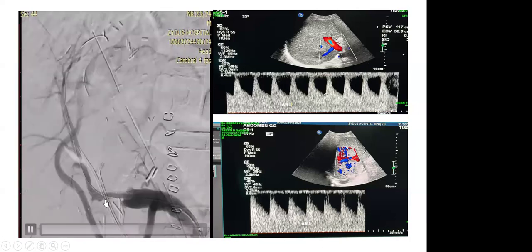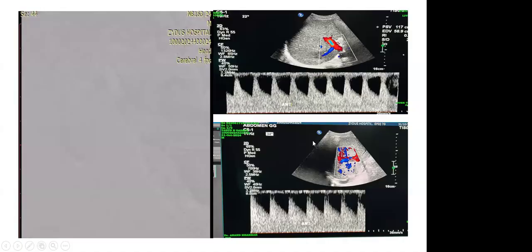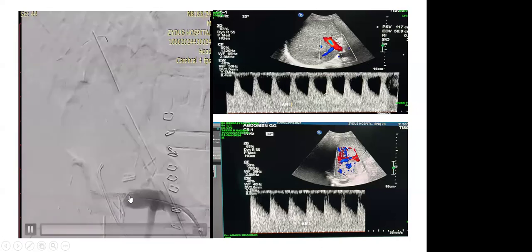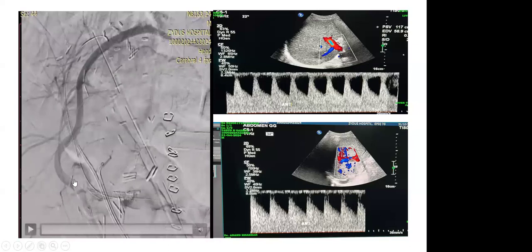Once you cross the stent across the anterior and posterior bifurcation, we should be more careful that it should not cover up. Anyway, post procedure, this is the Doppler study, and that is showing good systolic upstroke in the anterior branch. However, in the posterior branch, there is a filling from the collateral. If you can see, I don't have that post check angiogram also, that is filled from the anterior circulation, and some collaterals are filling the posterior branch.